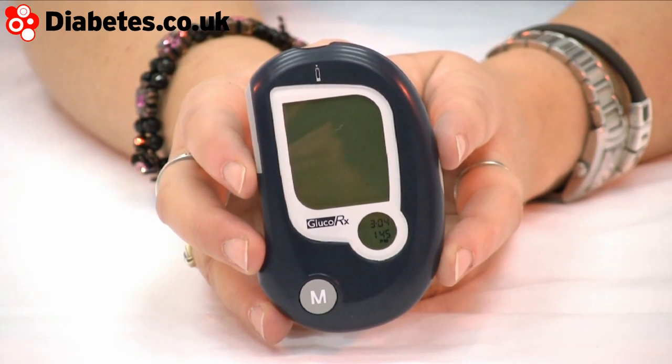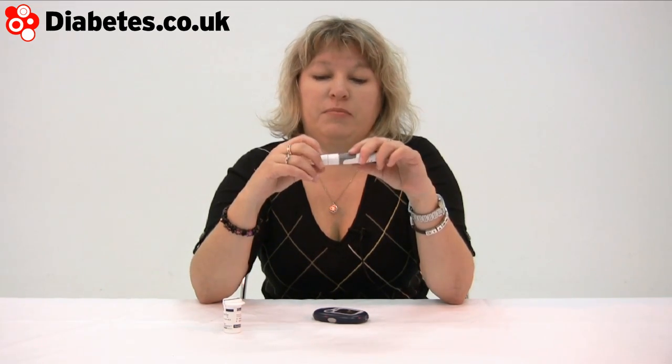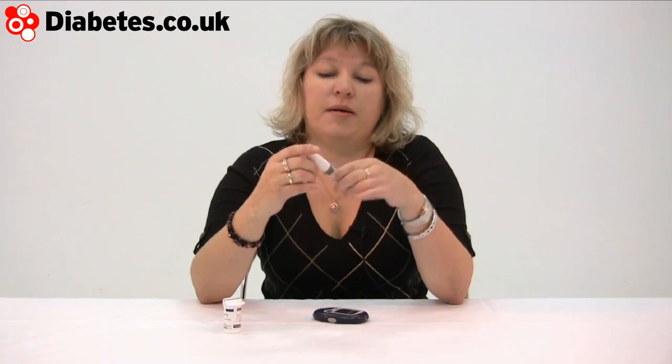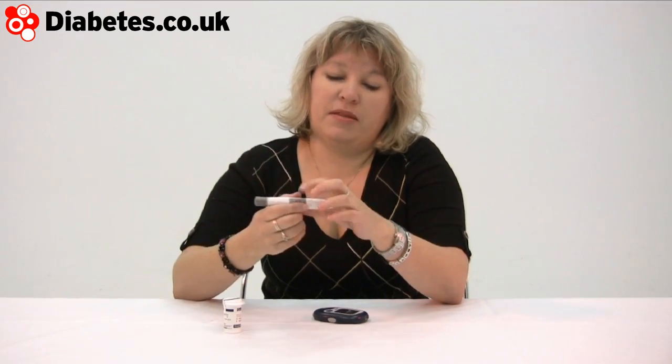This little machine is called the Gluco RX. Very simple to use and kind of neat. It's got a little dial there which gives you the time and the date. It has the usual sort of finger pricker — you dial up the penetration level with the marks on the side. The lancet's inside like that, then you prime it and release it with the button there.